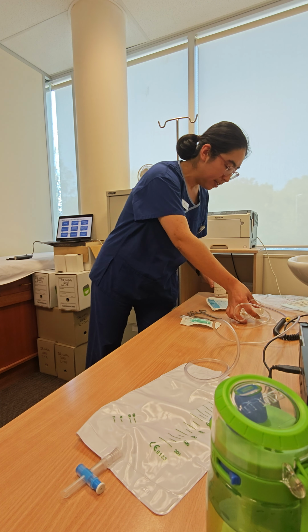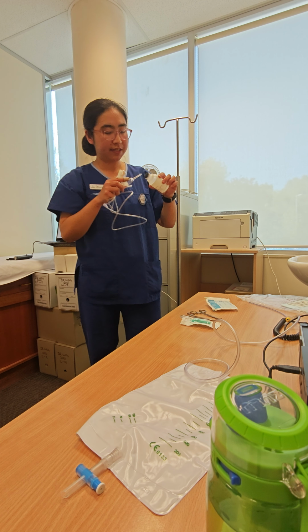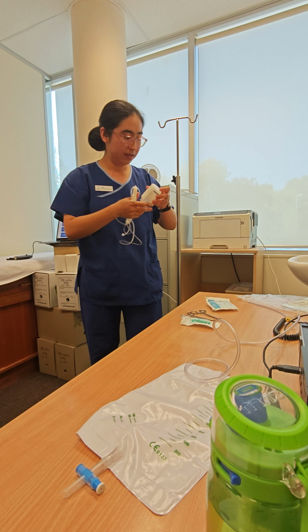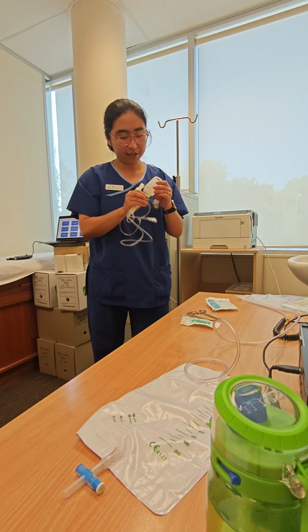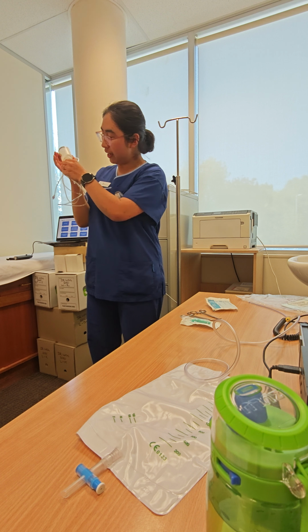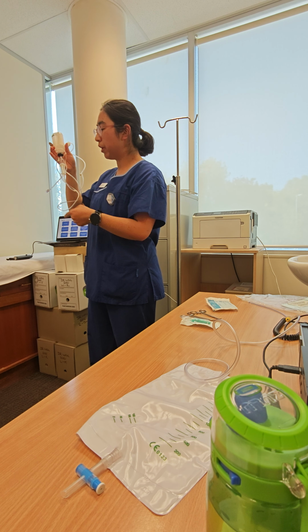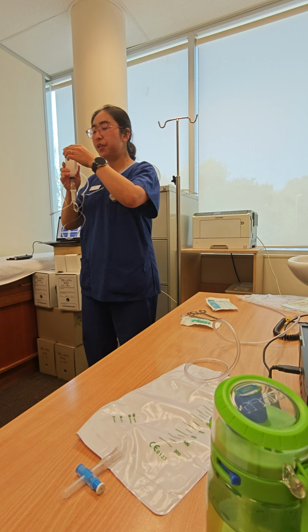All right. Even before we start, we can connect the infusion set to our contrast. Why do we use the needle here? We just spike the needle into the contrast bottle at the edge as well, because as we go, if we want the fluid to go down, we have to have some gas in. That's the reason we use the needle to set this up.